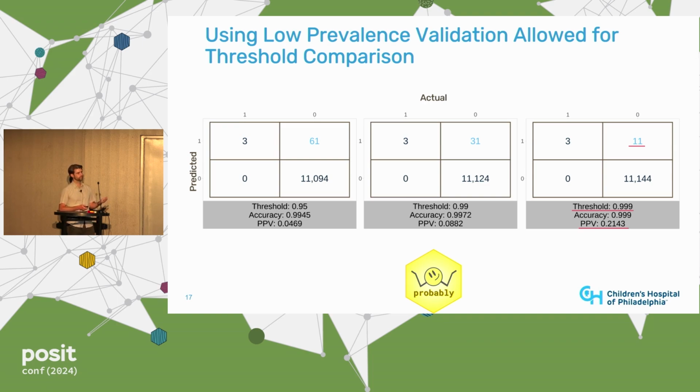Another positive, unintended effect of this kind of analysis is it helped to frame the discussion at, let's say, higher levels, like hospital administration levels, on the trade-off of implementing a model like this, which we know there will be false positives, we know there will be some unnecessary work, but we also hope that we prevent unnecessary patient harm from occurring if we're able to catch a WBIT error.